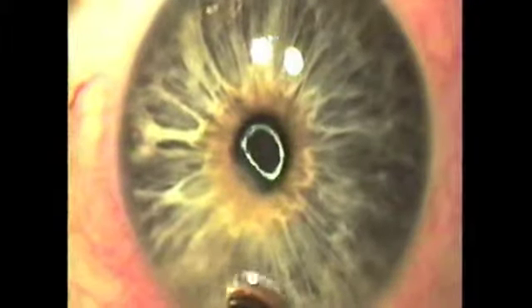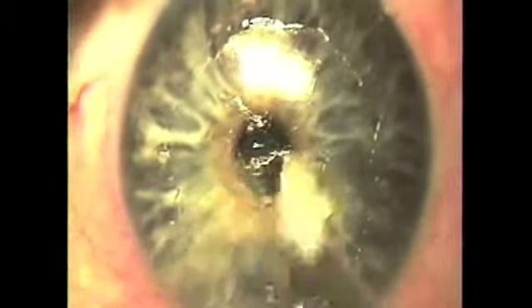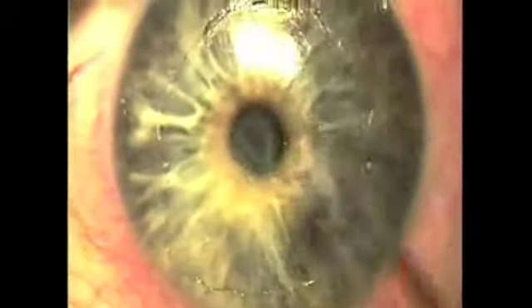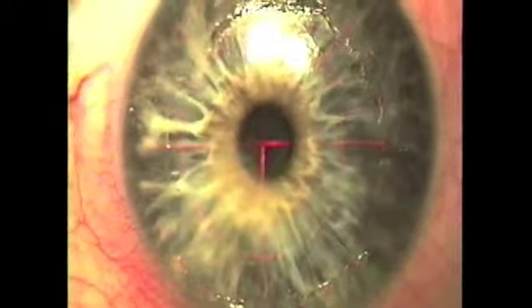This is a case of a dense corneal scar following a herpetic infection 20 years ago. Notice the circular light reflex here is D-shaped due to high astigmatism. With fast movements, take off the epithelium except in the area of the scar, leaving that for the last. Following my corneoplastic principles, herpetic scars usually become part of the cornea, so you'll see a smooth surface at this point. Notice despite the smoothness, the opacity is in its area, but that doesn't matter. You will proceed with the refractive ablation at this point.